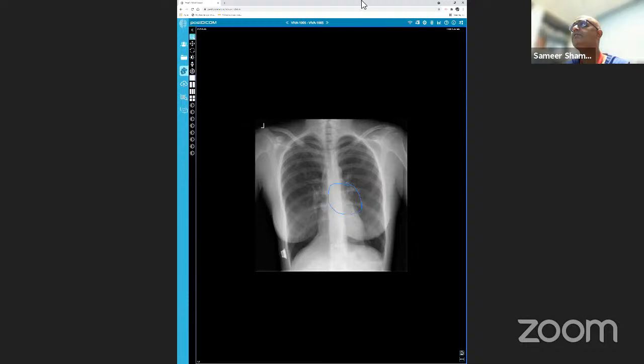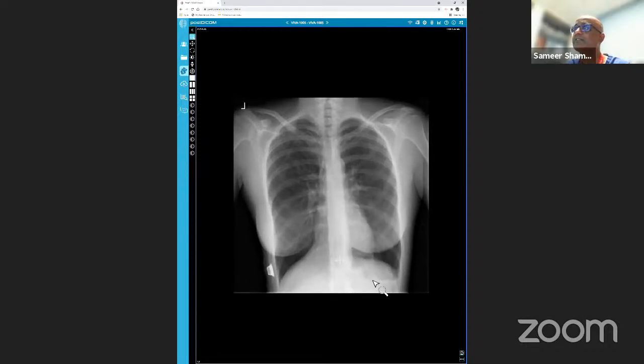I need to get rid of this annotation. So in this, it's a situs inversus, rightly picked up and correct. Whenever you get genetic conditions, in the final sentence, please ensure you mention genetic counseling and tracing and things like that.